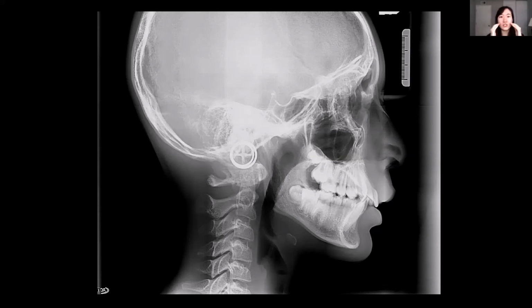Or is it just your top teeth sticking out but your bottom teeth are really leaning back? Or is it your jaws? Is your top jaw more forward or is your bottom jaw more back? Or is it a combination of all these things, whether it be the jaws or your teeth? This x-ray allows me to do certain measurements and I compare those with average. Then I'm able to determine where the discrepancy truly lies, and cater that treatment to target those areas of discrepancy.